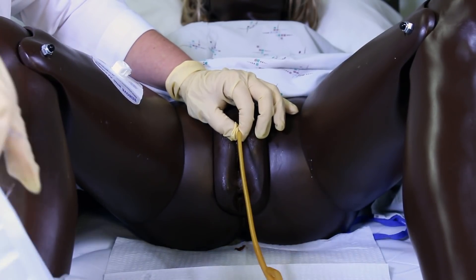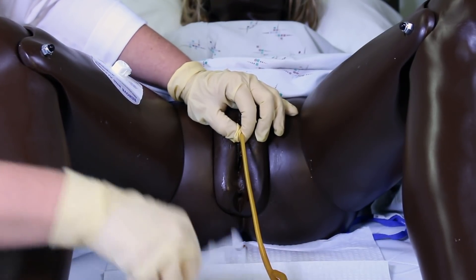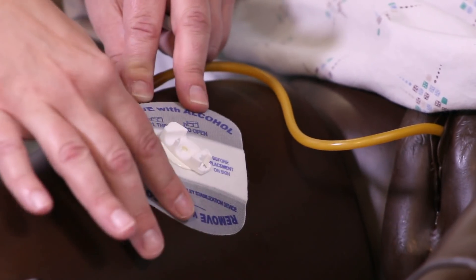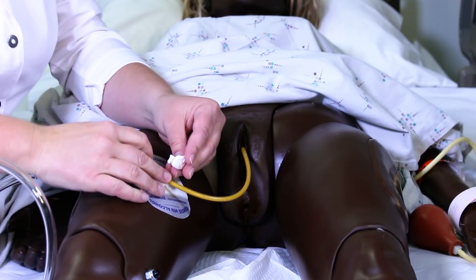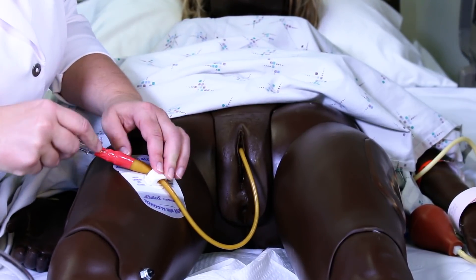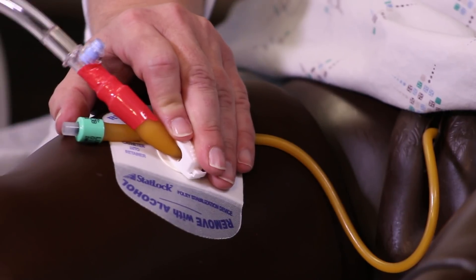I throw my equipment away and then attach to the patient's leg with a stat lock, which can lock your Foley catheter tube in place. Not all facilities have them, but they're very handy — attach the Foley tubes into the stat lock and it's secured. If your facility doesn't have stat locks or Foley fasteners, you can use tape on the patient's leg as well as extra tape on top to secure the Foley catheter. Then hang the Foley bag hook on a non-movable portion of the bed, make the patient comfortable, and document your procedure.